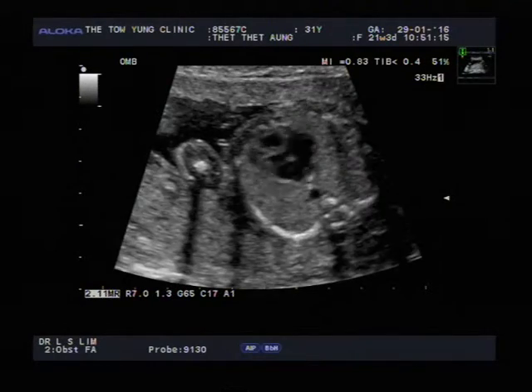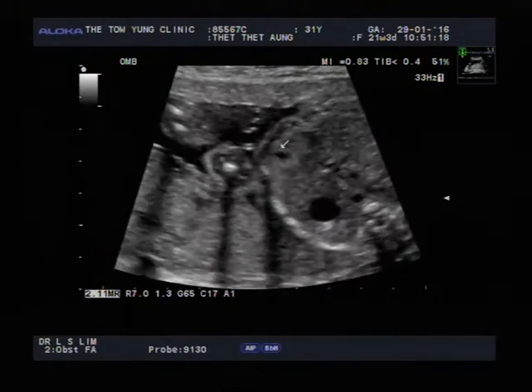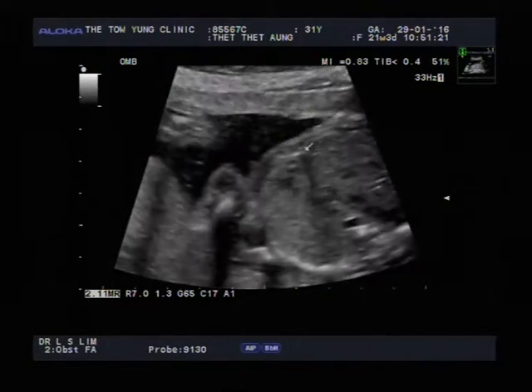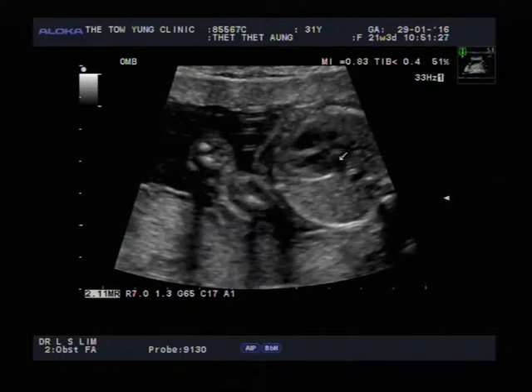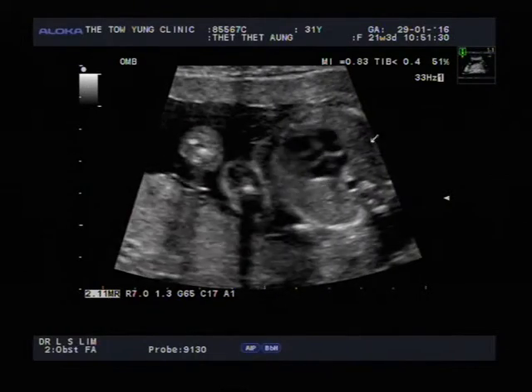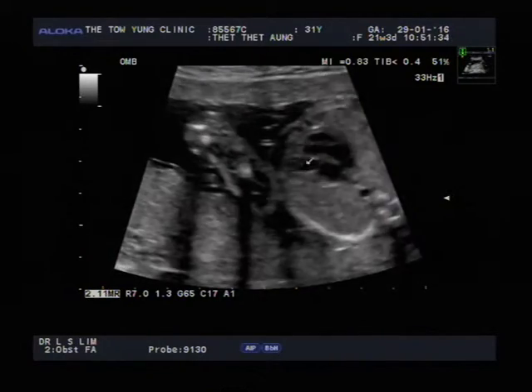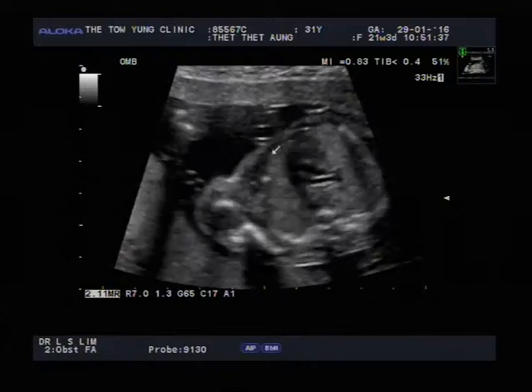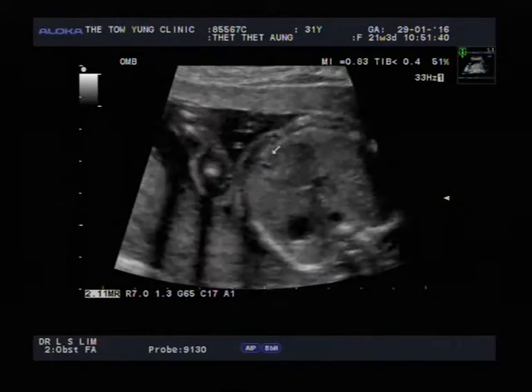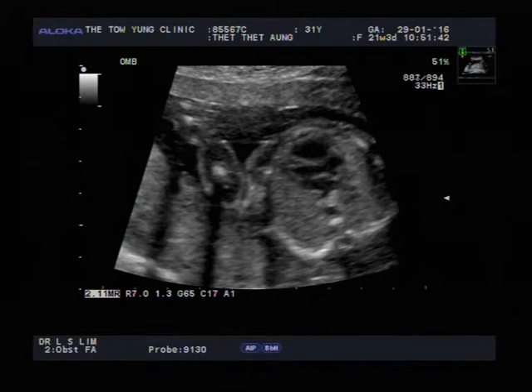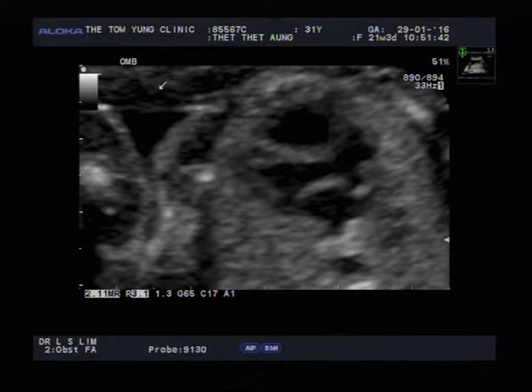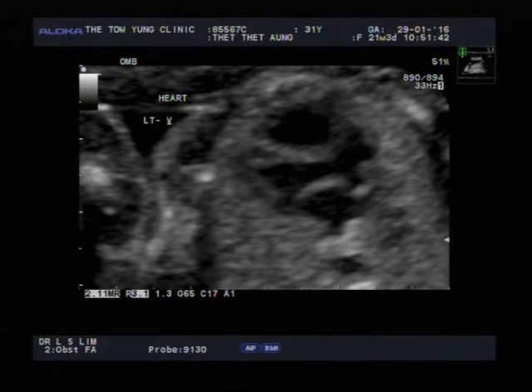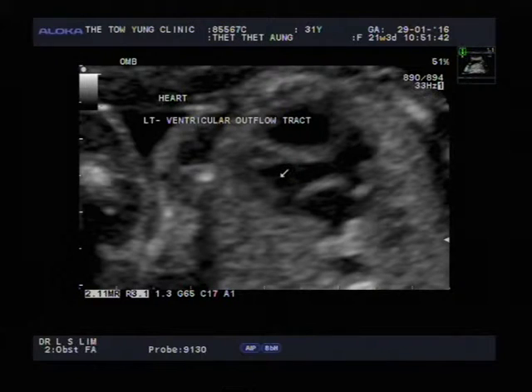I've just enlarged the picture so we can see the baby's heart clearly. We want to see the four chambers — they are very important. The lungs are on the right side and the left side — those are the lung fields. This is one very good view of the baby's heart. This particular view is called the left ventricular outflow tract. It shows the left ventricle chamber of the baby's heart — LV for short.